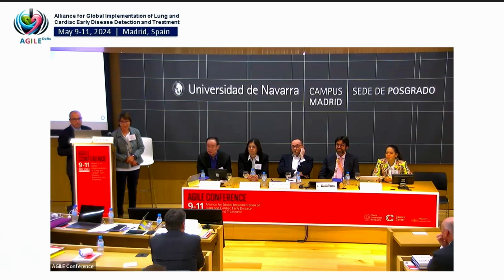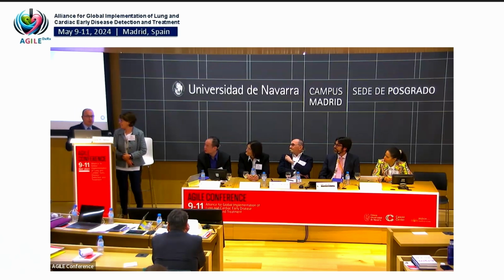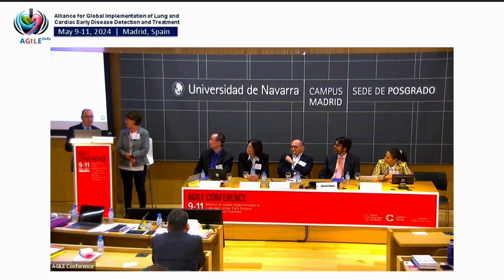I just wanted to know how many were pulmonologists versus radiologists. Okay, so next time we'll do it like David showed before. We will ask in the beginning how many are these, and then we can see. But it's a good point because I think pulmonologists deal differently with these findings than radiologists.